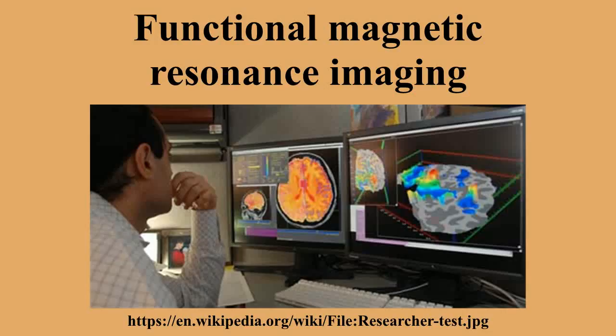A single voxel's response signal over time is called its time course. Typically, the unwanted signal, called the noise, from the scanner, random brain activity and similar elements is as big as the signal itself. To eliminate these, fMRI studies repeat a stimulus presentation multiple times.